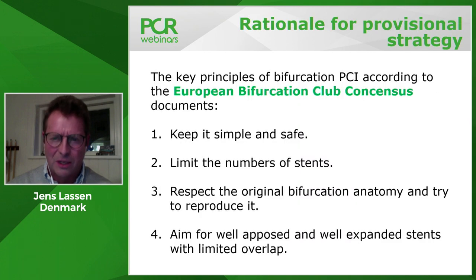because that depicts actually some of the steps that we like to push forward as the philosophy of stenting. First of all, we say keep it simple and safe, which means if you go for two stents up front, you will always end with two stents in the bifurcation, and then it changed from simple to complex. If you go with one stent and move forward in a stepwise fashion, you can end with two stents if needed, but only if needed. And that made it actually possible to stop at each step during the procedure. That would limit the numbers of stents, because sometimes it's possible, most times it's possible.